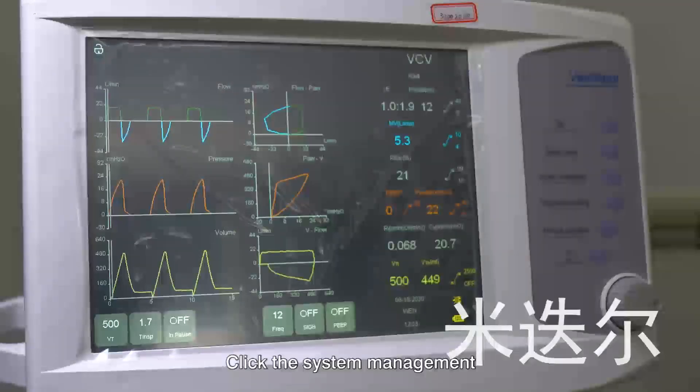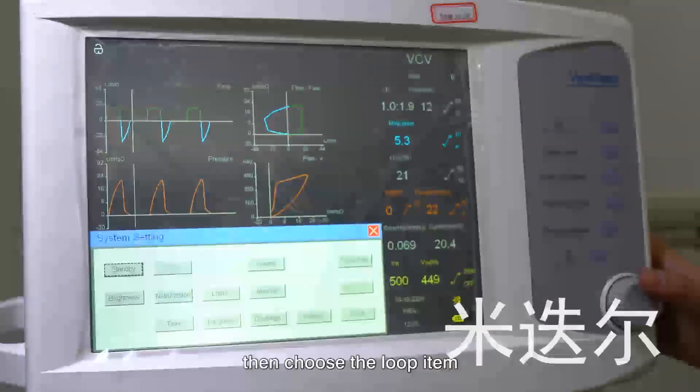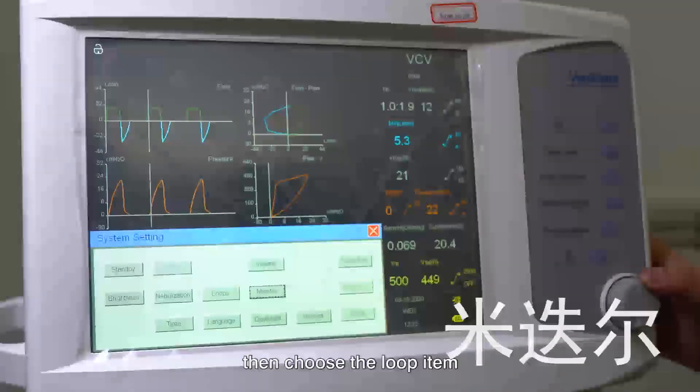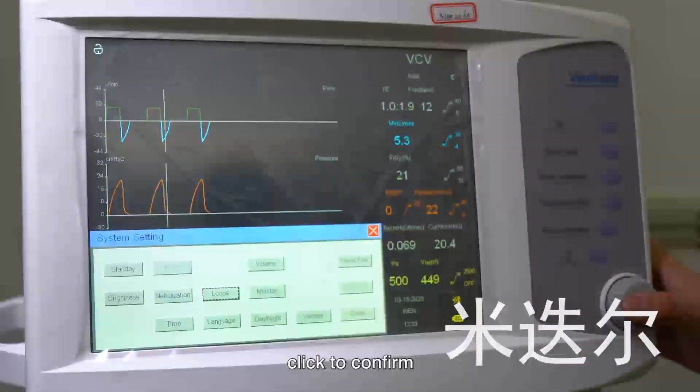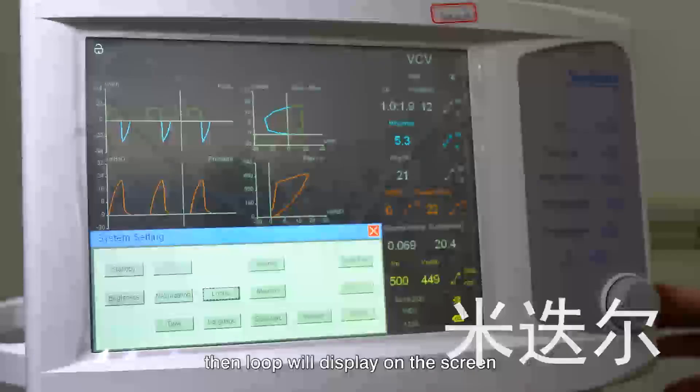Click the system management, then choose the loop item. Click to confirm, then the loop will display on the screen.